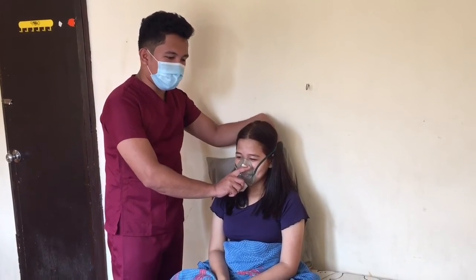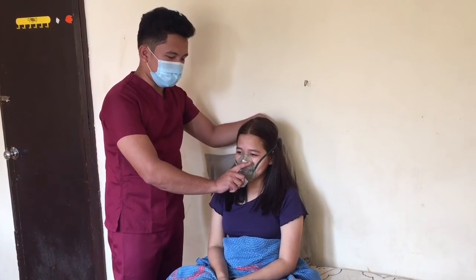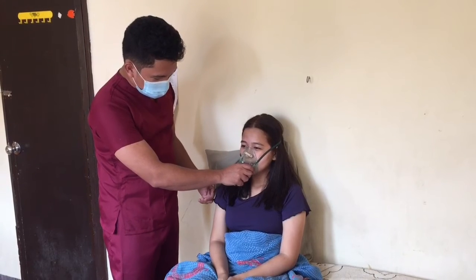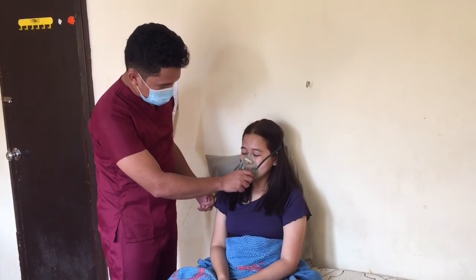Secure the elastic band around the client's head so that the mask is comfortable. So, today ma'am, is the breathing okay? Yes, nurse.